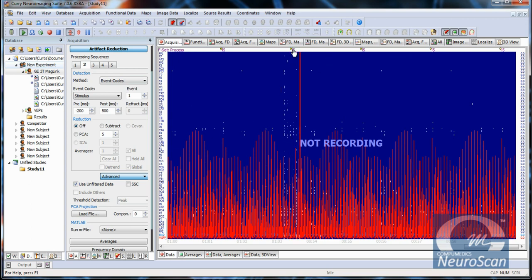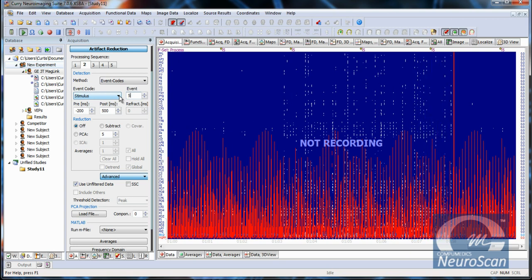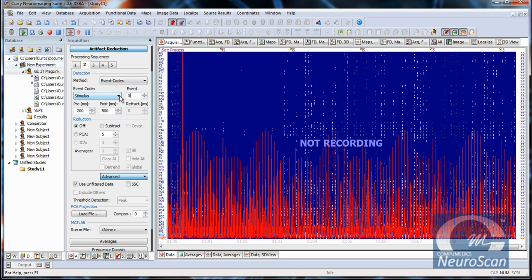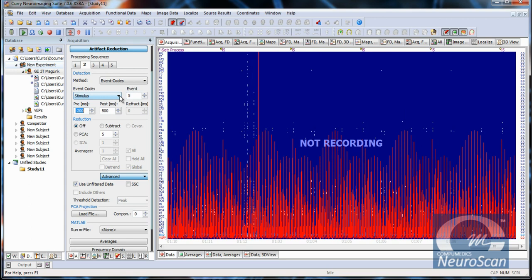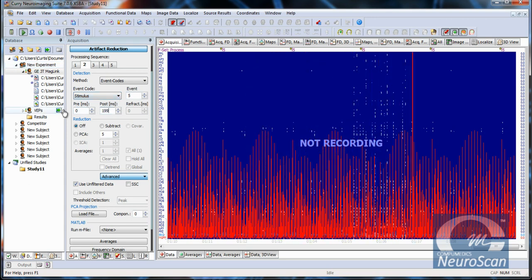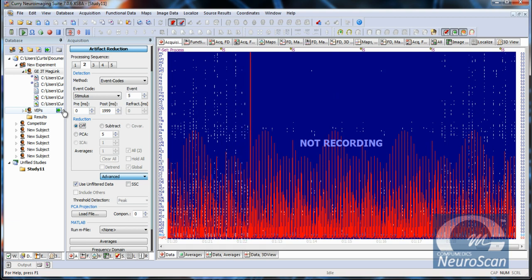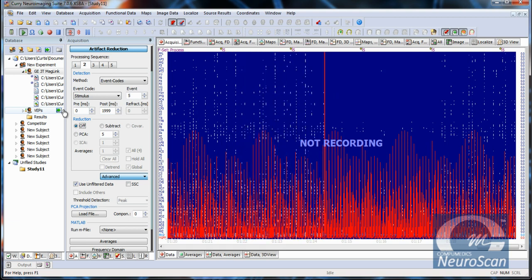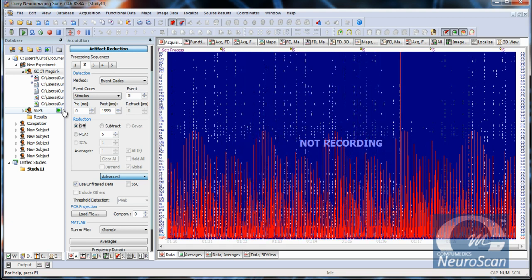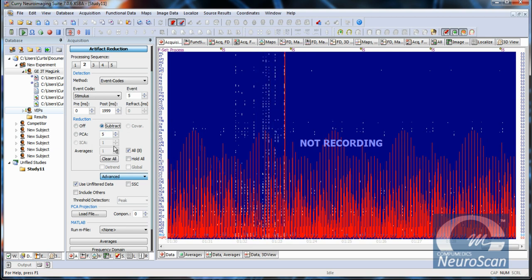The numbers shown here, which are 5s, indicate the value that we have applied to these TR onsets, and we simply set the interval, which in this case is a 2000 millisecond TR, which starting at data point or time point 0 extends out to time point 1999 milliseconds. We will use the so-called Allen method or subtraction technique.